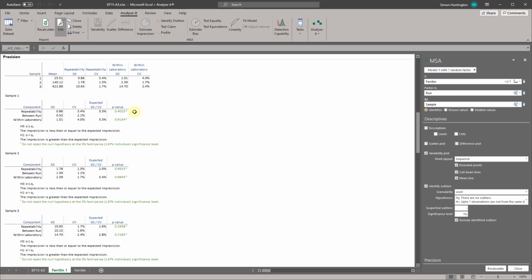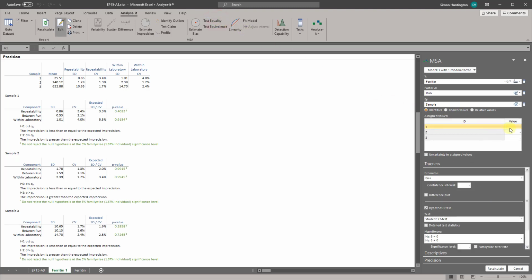To estimate the bias of the measurement procedure, go to the Analyse-it ribbon tab and in the MSA group, click Test Equality. The Trueness panel opens. Now, in the Assigned Values grid, in the Values column, type the known values of the materials. Note that CLSI EP15-A3 only gives the assigned value for sample 2. We have fabricated values for the other samples for demonstration purposes.